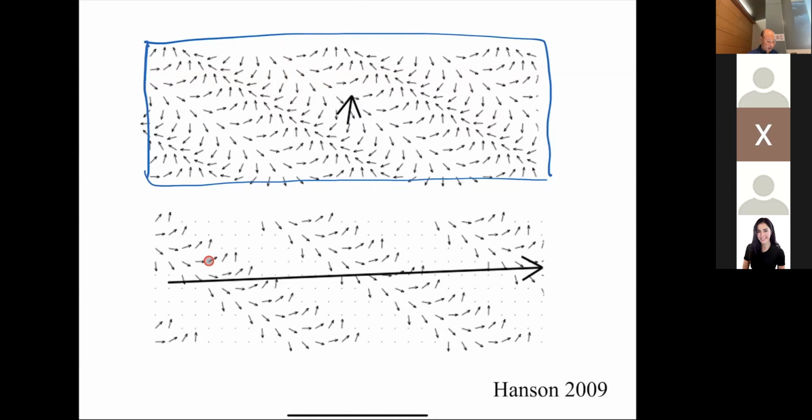It's just diagonal stripes of chocolate with protons in them. And now you can sort of see for this spin, there's really not a spin that's going to cancel it out very much, right? And so now when I sum up all these spins, I get a pretty big number. Okay. And so that's the idea that when the Fourier transform pattern, the spatial pattern matches your object, then you expect that Fourier coefficient to be relatively big. Okay. So the integration is what does that for you, right? You're integrating over all these different phases. And if the phases line up, you get a big number. And if the phases cancel out, you get a small number. All right.